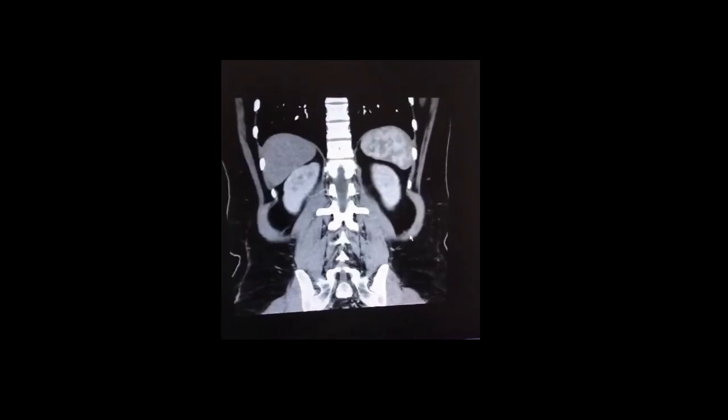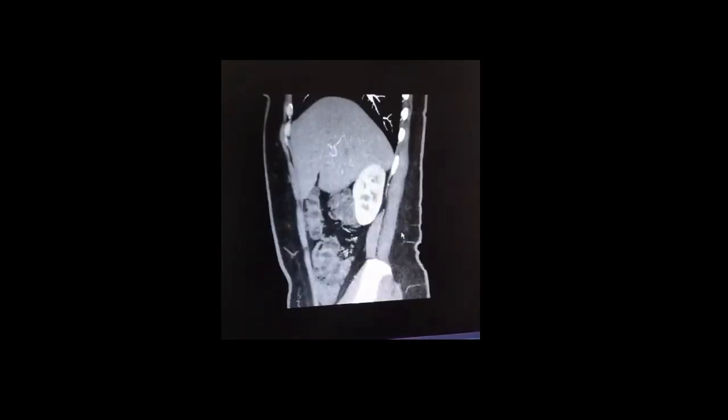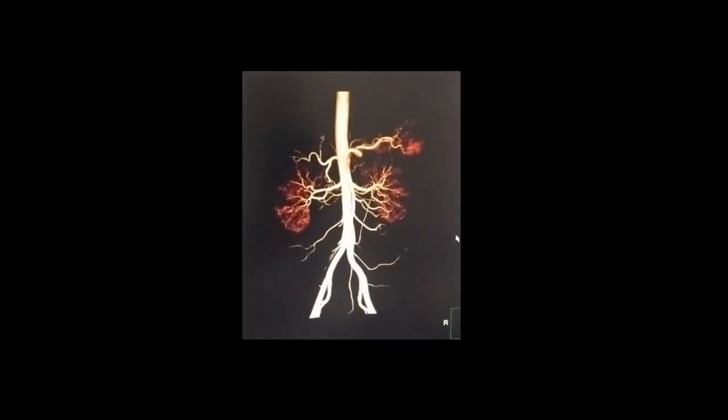4. Late hepatic arterial phase, 40 to 55 seconds. Description: peak hepatic arterial enhancement. Images: liver images with intense arterial enhancement, often used to differentiate lesion vascularity.